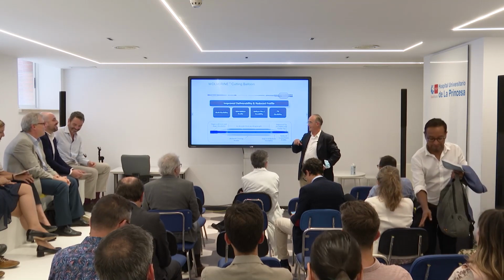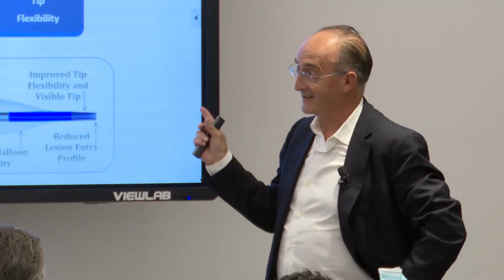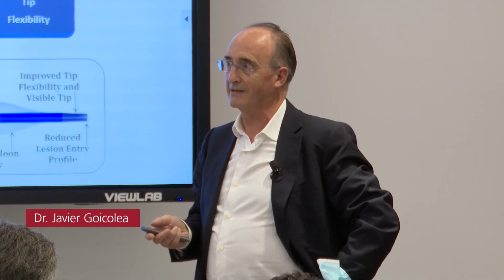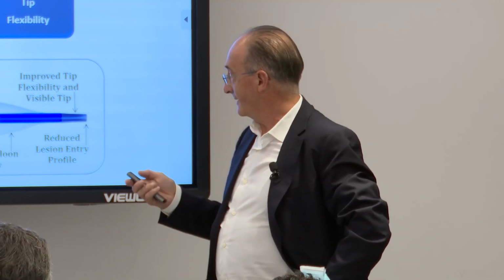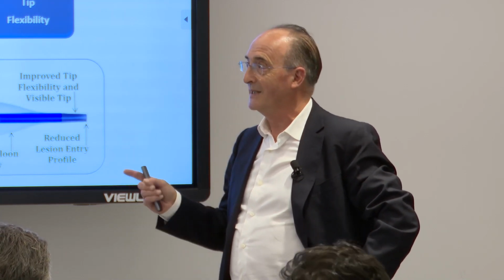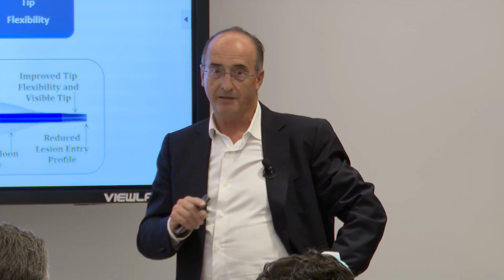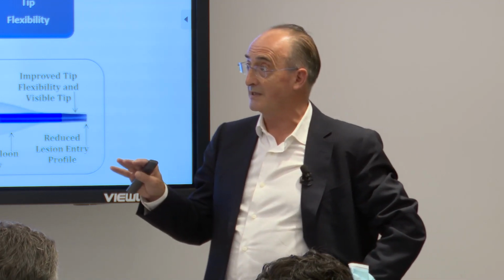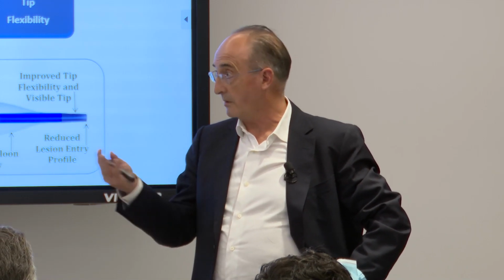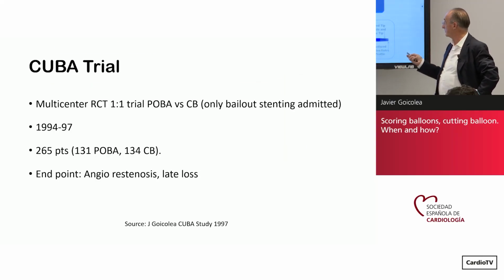We're going from the teenager, the European, to the newborn, and then we're going to the old guy, because this is an old guy. It was the early 90s that we started with the cutting balloon. And of course, it wasn't like this. It was another device. And we had the same problems that we have with lithotripsy, that we do not reach where we want to reach. Occasionally calcified lesions are very difficult to reach. That is a major limitation with lithotripsy, which is not so with rotablator or even with OPN.